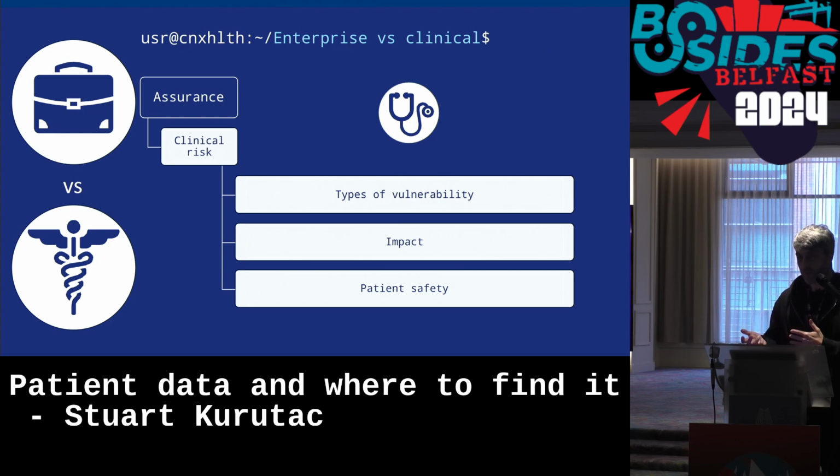On the flip side of that, some researchers from McAfee found an infusion pump with a CVSS score, a common vulnerability scoring system score, of 9.8, so they could remotely control this thing and deliver a deadly dose of whatever was in there. You look at the NHS website for that and their own impact scoring on that, and they put it down as a low. So technical risk doesn't always relate to clinical risk. That's just something to be aware of. And the reverse is also true as well.